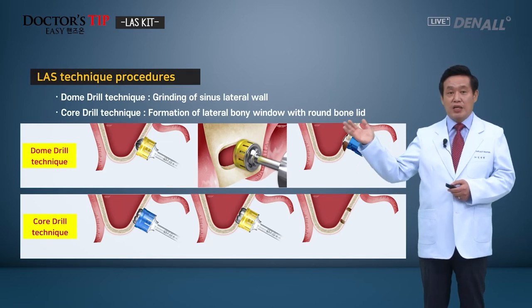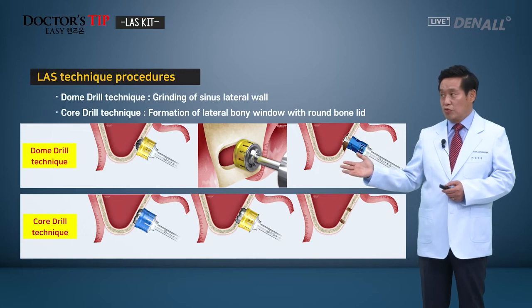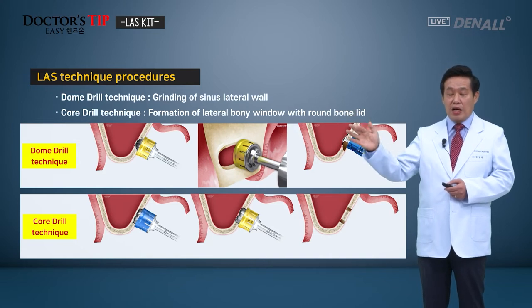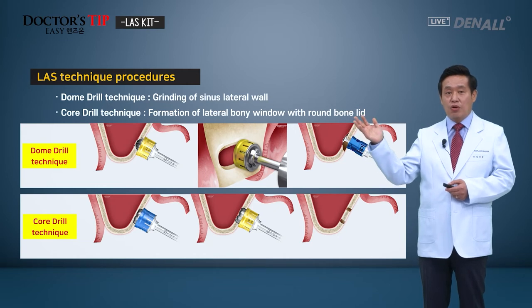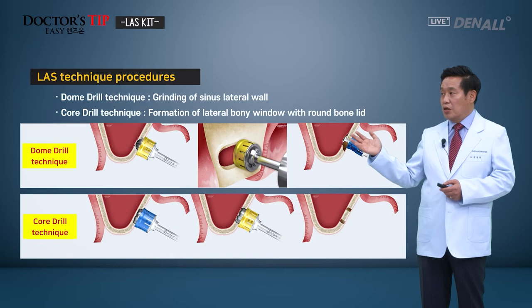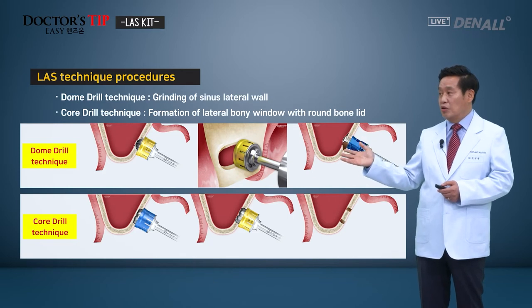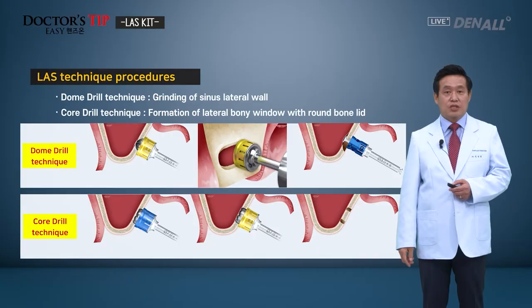So the last technique, the basic procedure, is the following. Basically, there are two techniques. You can use the dome drill, or you can also use the core drill. If you use a dome drill, you grind the sinus lateral wall in the window formation. That's how you form the window through grinding of the sinus lateral wall. With the core drill technique, you form the lateral bony window with a round bone lid. So that would be the core drill technique.